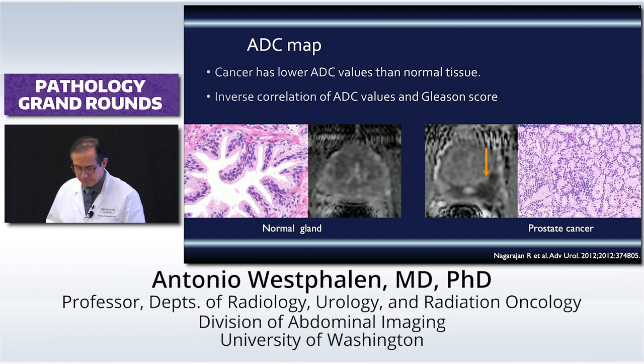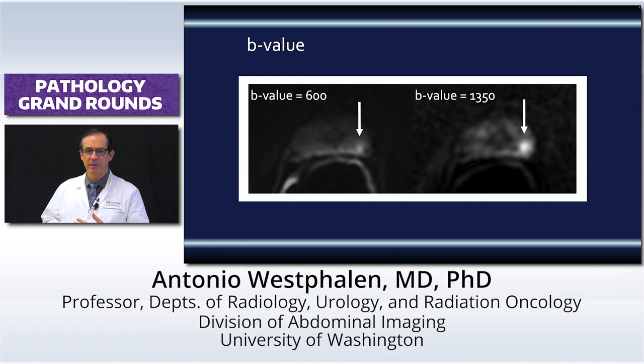Now, again, this is just to mention why you may hear things, people talk, oh, was this a B value? And I hear this from colleagues, oh, do you do multiparametric? And patients do multiparametric, I do, we do multiparametric MR, we have done this forever. And do you use high B value images? Yeah, we use high B value images, but what is it, right? What's the point of it?